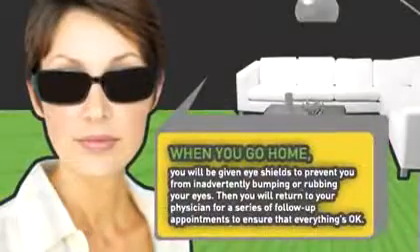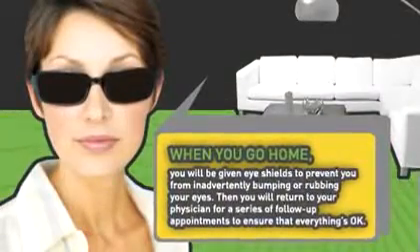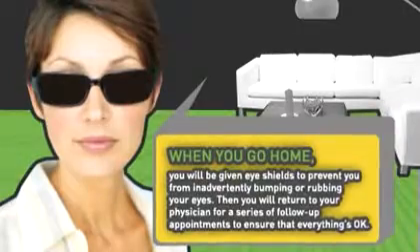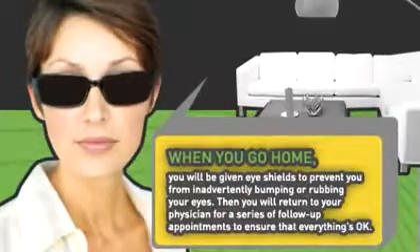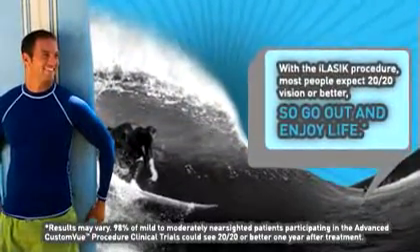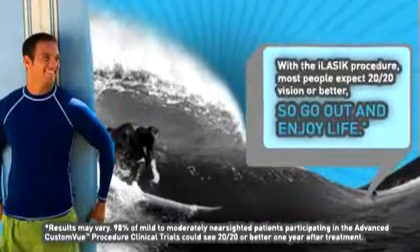When you go home, you will be given some eye shields to prevent you from inadvertently bumping or rubbing your eyes. Then you will return to your physician for a series of follow-up appointments to ensure that everything is okay. With the iLASIK procedure, most people experience 20-20 vision or better, so you can go out and enjoy life.